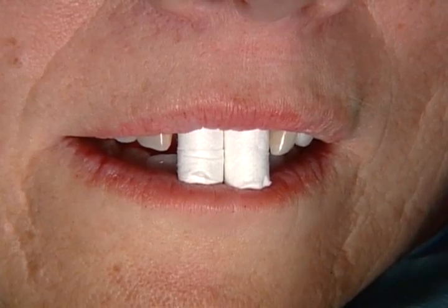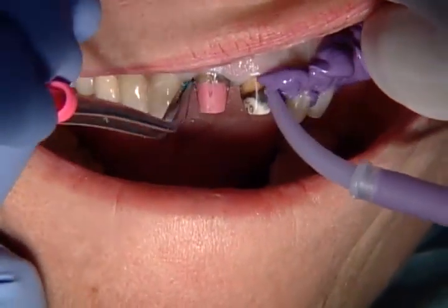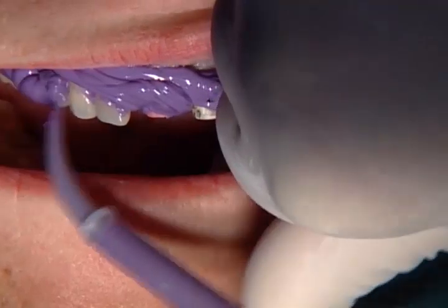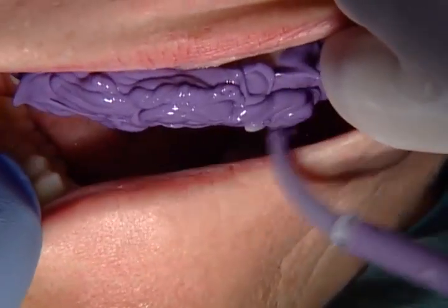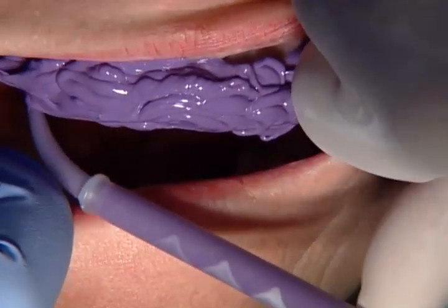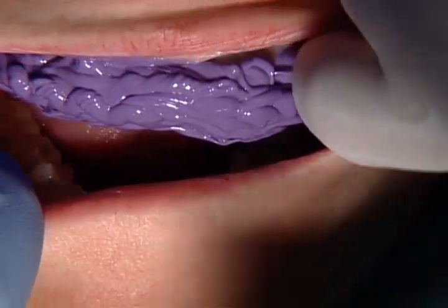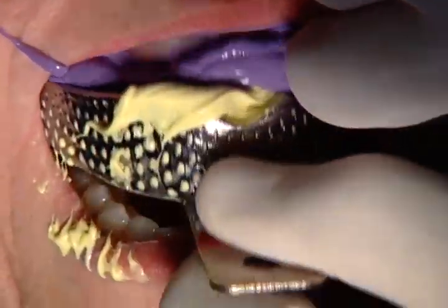And then I'm going around and expressing material around the rest of the teeth, and then coming around and going around the 2 prepared teeth and then to the rest of the teeth and back over these teeth again. This is especially important if you're doing no prep veneers in conjunction with a couple of other restorations. And here we're not sure if we're going to do no prep veneers or not. She was kind of on the fence, but I'm taking a polyvinyl impression where I express that material along all of those other teeth to make sure I have a nice master model for the laboratory to look at.